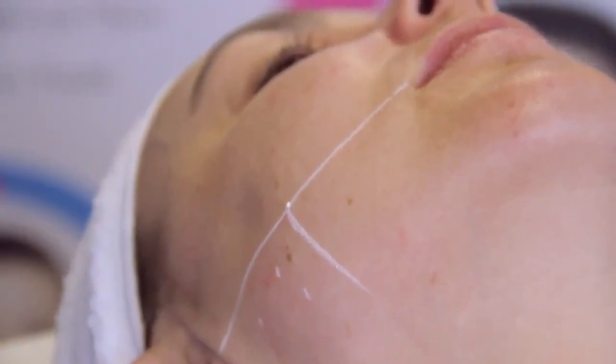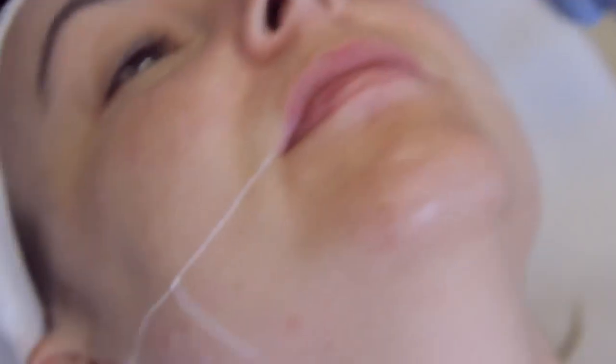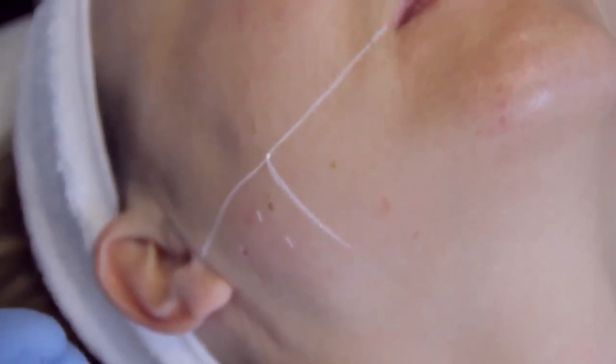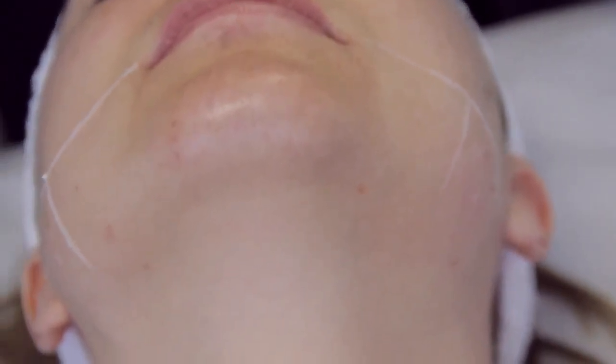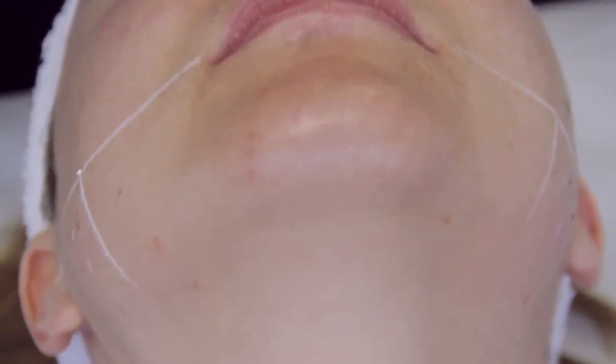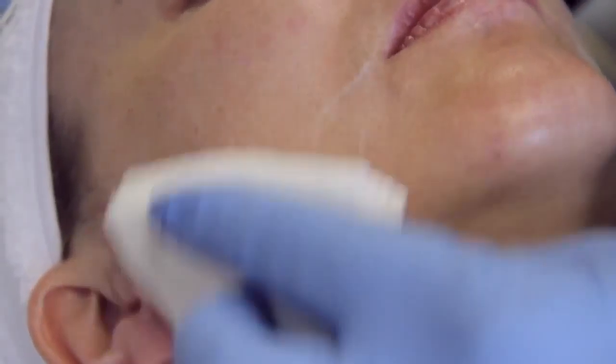You can see minimal bleeding there and it's a pain-free procedure. The main thing we need to do is make sure the injections are symmetrical so that the result is symmetrical also.